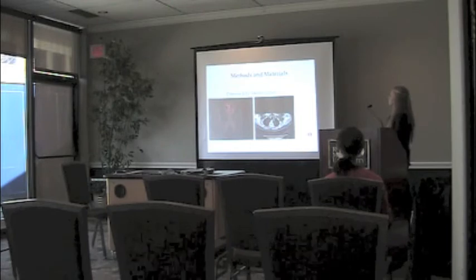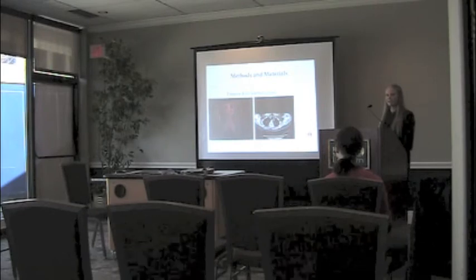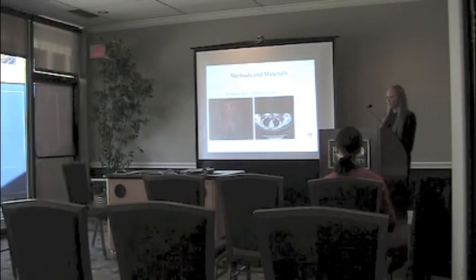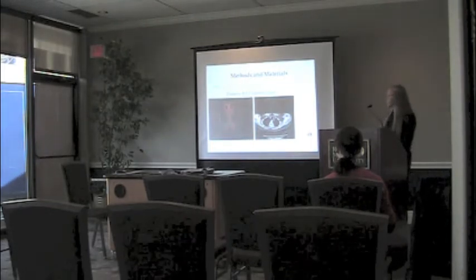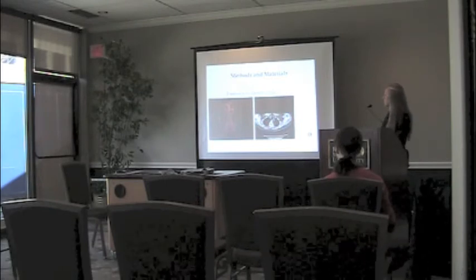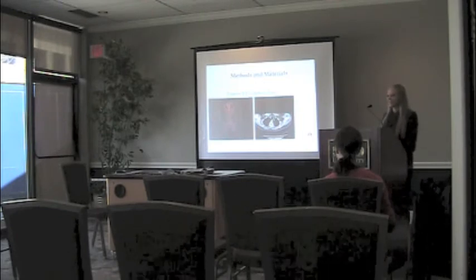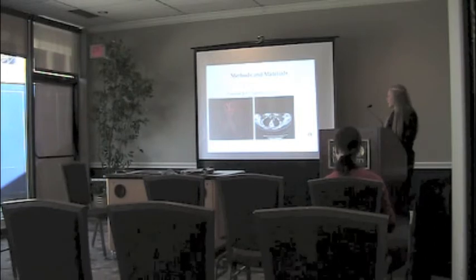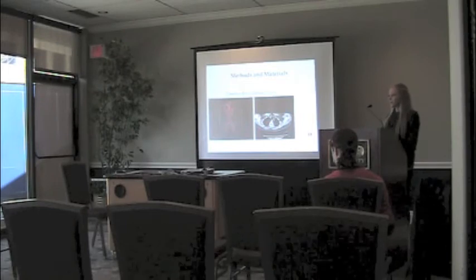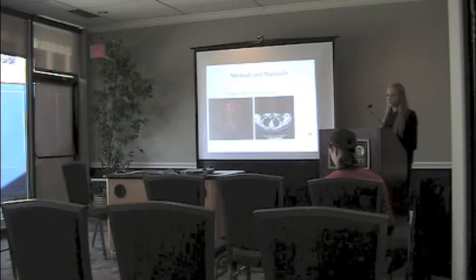On your left is the PET-CT fused image. The colored portion of it is the PET portion, and this means there are high metabolizing cells there. The brighter the color, the more metabolizing cells there are. So we see increased uptake bilaterally and symmetrically. Then we look at the CT image, where we would see if there's any abnormal anatomy within the body. Here we would say there isn't a mass that we're seeing, so this would be positive for BAT.